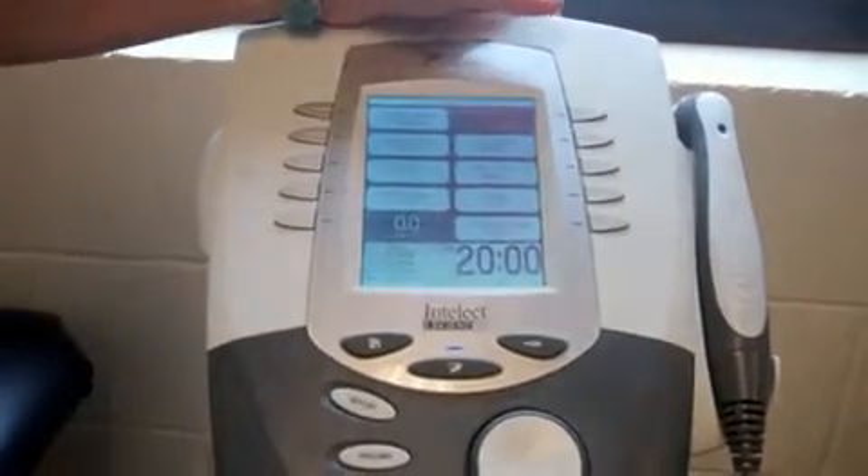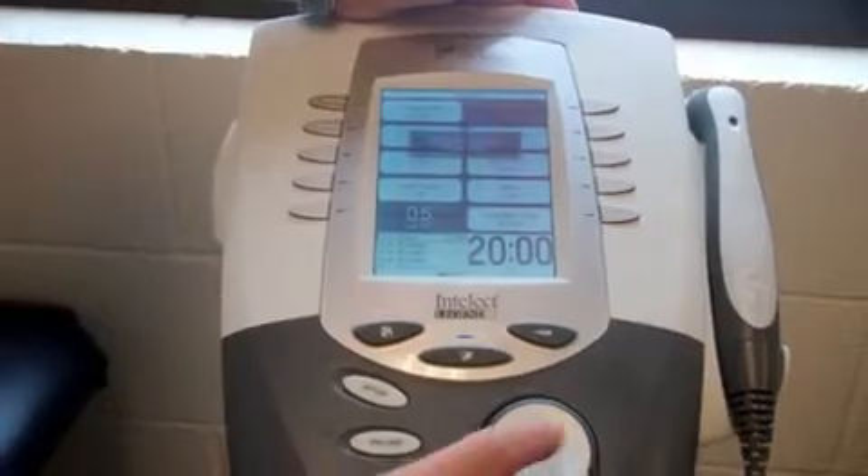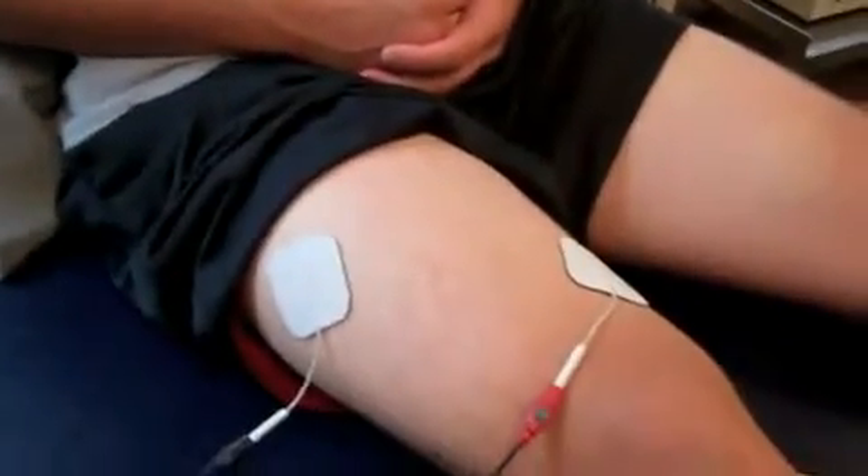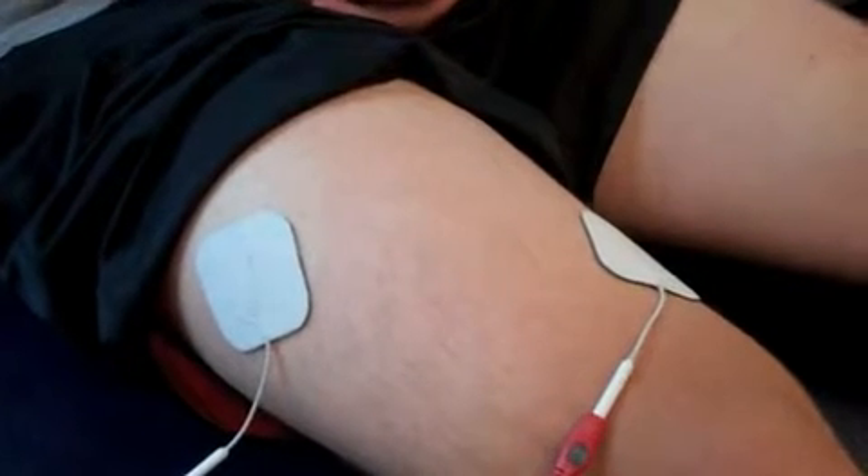Then we start to turn up the intensity and push start. We'll watch the muscle — we want a nice strong contraction.